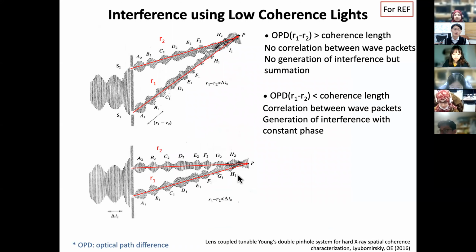Here it comes. I want to bring your attention to this, again, for young students who did all this calculation of free-space optics and homeworks. But when you actually do the experiment, things are not as ideal. Why? Looking at the top and bottom cases, this R1 and R2, the optical path difference is way longer in the top compared to the bottom one. But look at the difference.